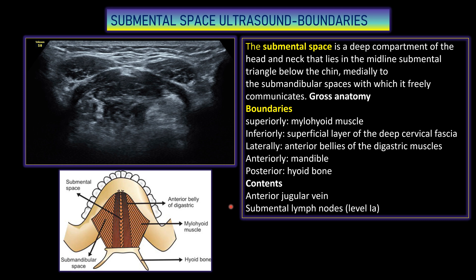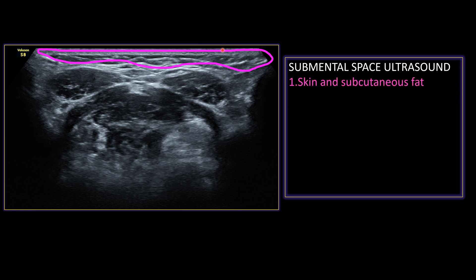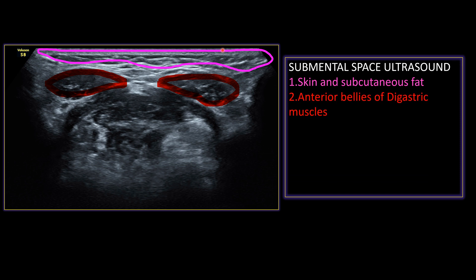This is the typical submental space boundary overview. Now we will look at what the frog face view is and what parts comprise it. The area shaded in pink is the skin and subcutaneous fat. Both structures here are the anterior belly of the digastric, which mimics the eyes of the frog.